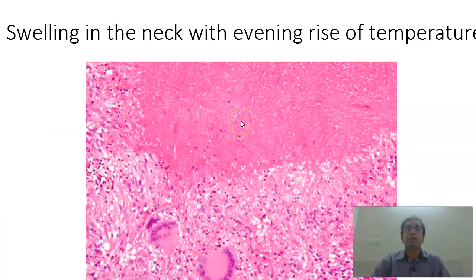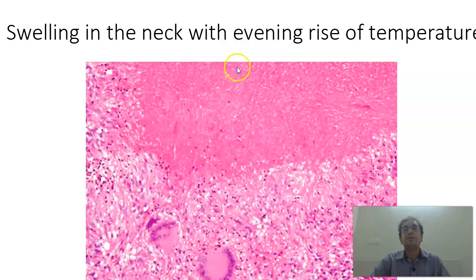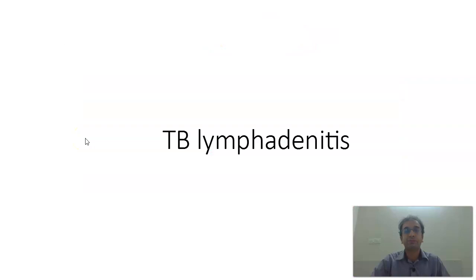Next case is swelling in the neck with evening rise of temperature. What you find here is caseous necrosis in the slide, Langhans-type giant cells, and slipper-shaped nuclei of the epithelioid cells. All this put together points towards a tuberculous granuloma. The history is also very classical — evening rise of temperature. It is tuberculous lymphadenitis.